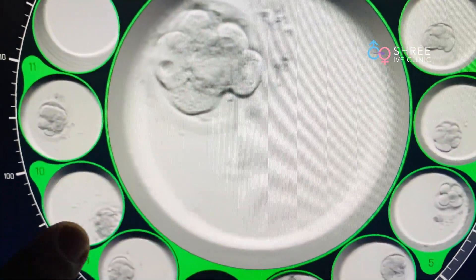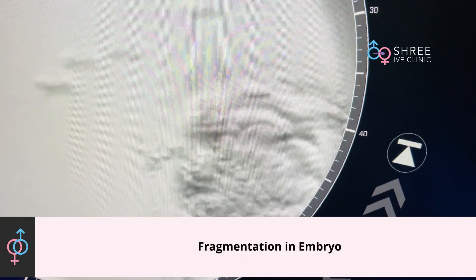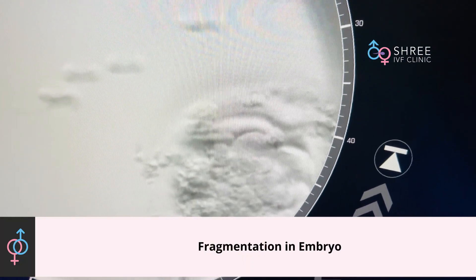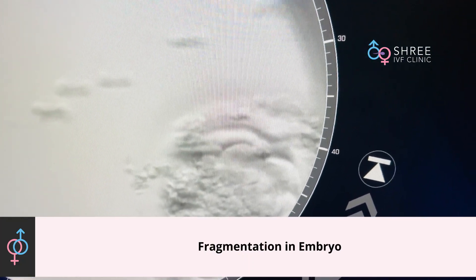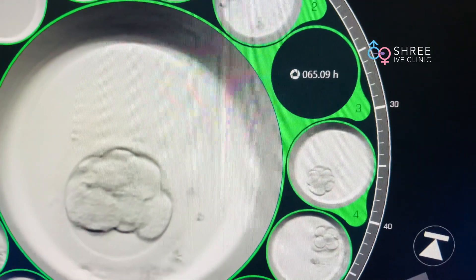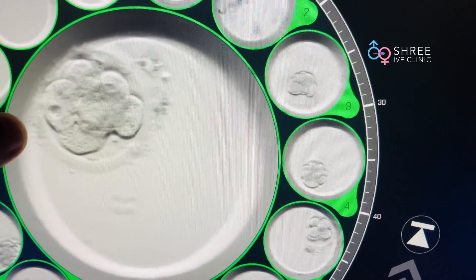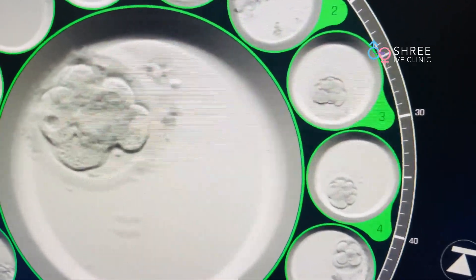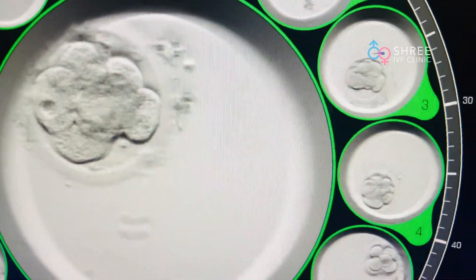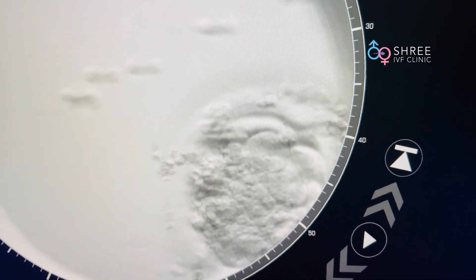Let's look at the last one — this is a bad one. This embryo has a lot of granulations in between, which is called fragmentation. Fragmentation means the cells are not looking as good as they should be. Compare it to the non-fragmented embryos we saw earlier — the embryo should ideally look like those. This one with a single vacuolation and these three good embryos are all better than this fragmented embryo.